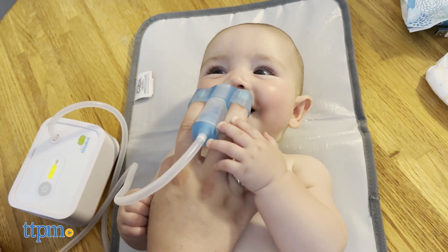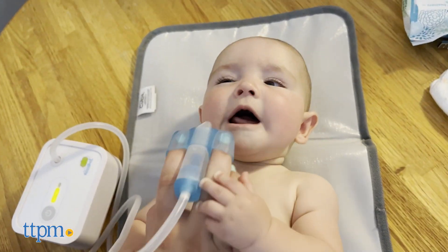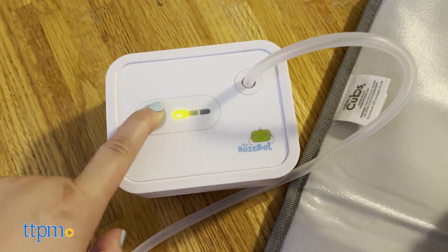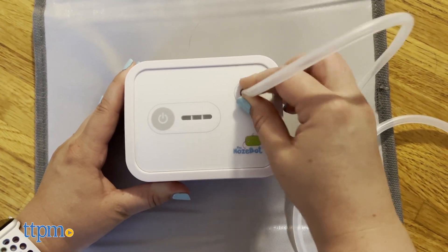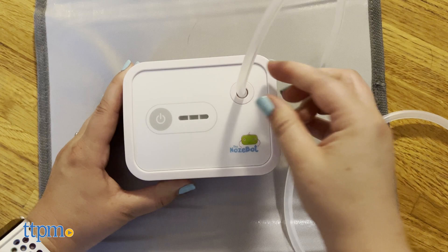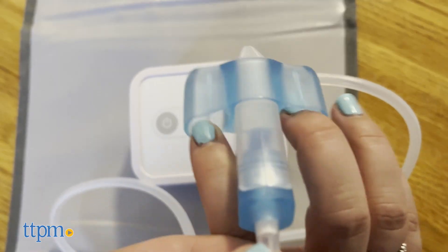This is a battery-powered nasal suction device for infants. There are three levels of hospital-grade suction on the device. Unlike all the other nasal aspirators, this one you hold using your pointer and middle finger, which gives you your thumb and ring finger free to hold your child's face still if needed.